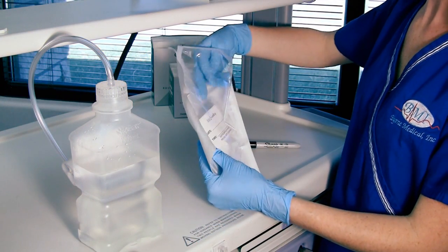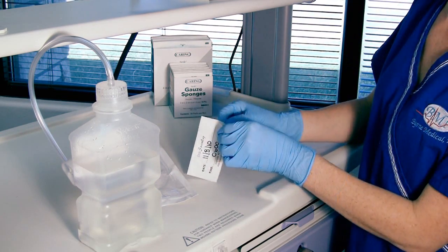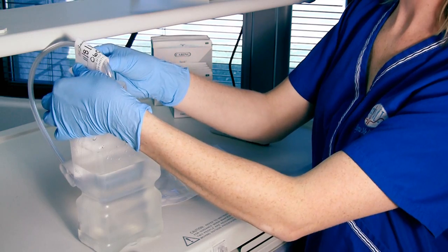After the Smart Cap is snugly tightened, take out the sticker in the pouch and fill out the date and time you opened the pouch seal. Then place the sticker around the Smart Cap tubing. This will ensure that everyone will know exactly how long this cap has been in use.